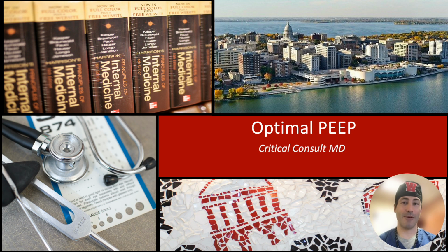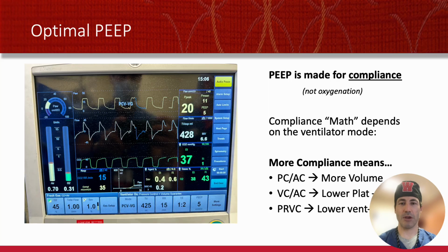Good morning. Today I want to talk about optimal PEEP in a really practical bedside way. Not all the PEEP math and details, but what you can know and learn to quickly figure out what a good PEEP is in a patient in the ICU or in the operating room.